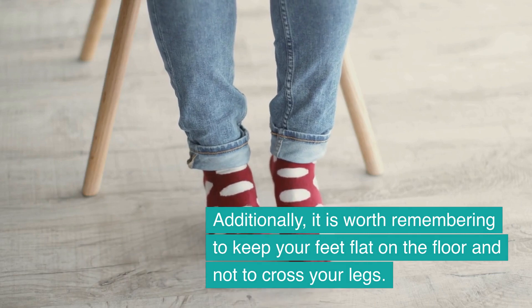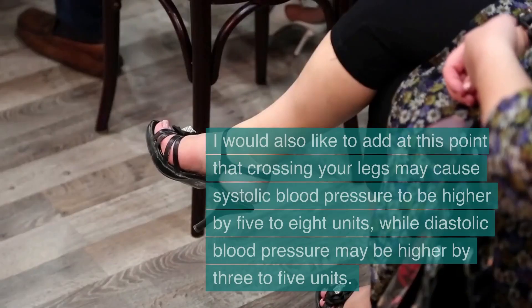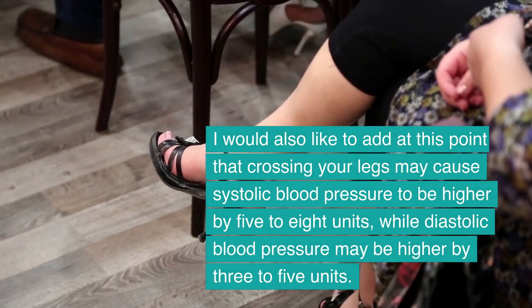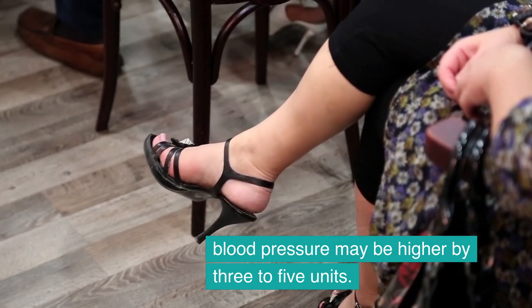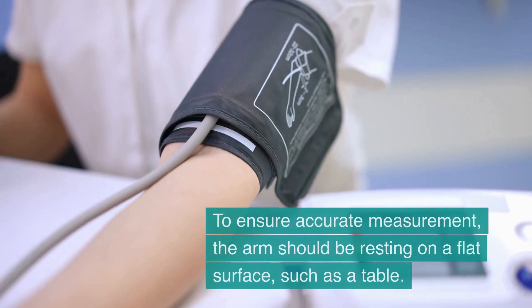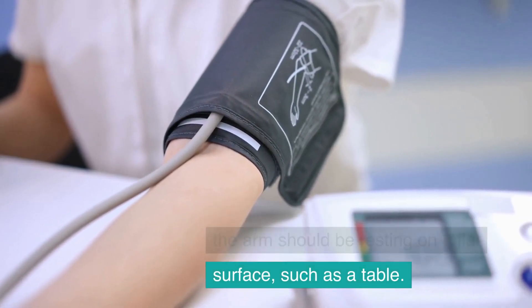Additionally, it is worth remembering to keep your feet flat on the floor and not to cross your legs. Crossing your legs may cause systolic blood pressure to be higher by 5 to 8 units, while diastolic blood pressure may be higher by 3 to 5 units. To ensure accurate measurement, the arm should be resting on a flat surface such as a table.